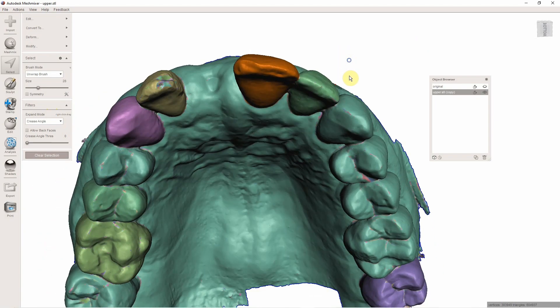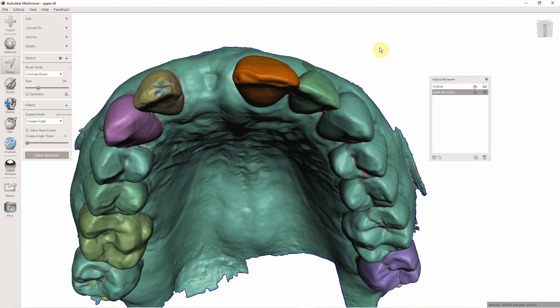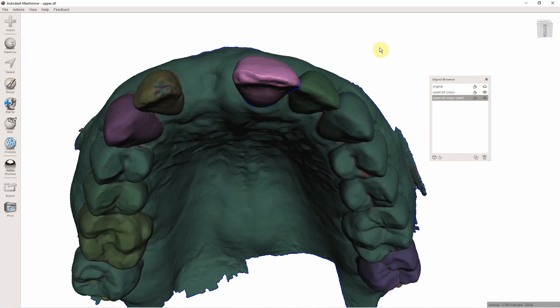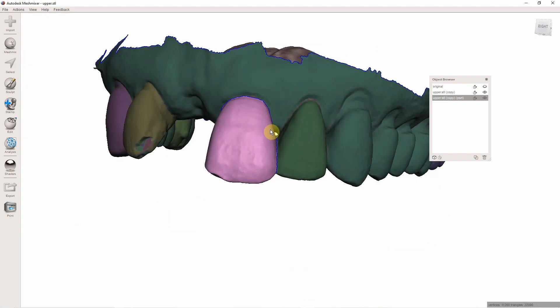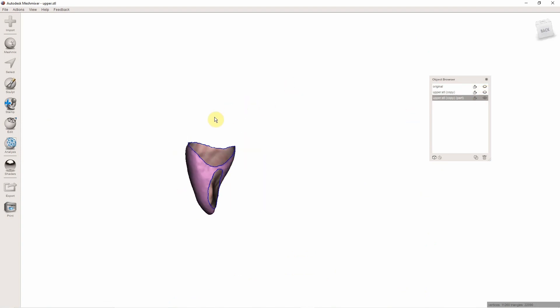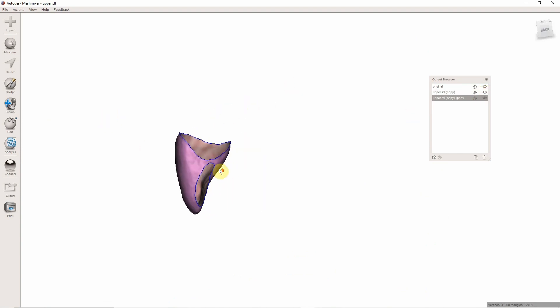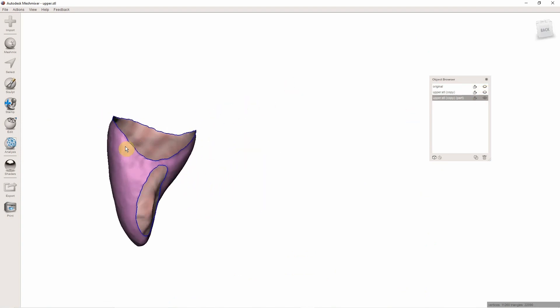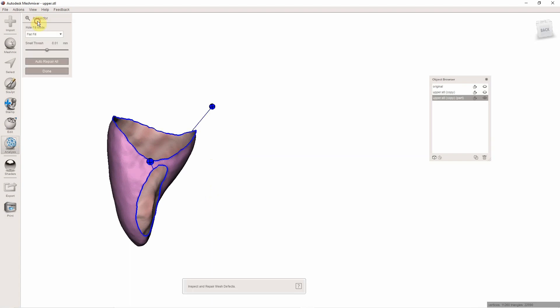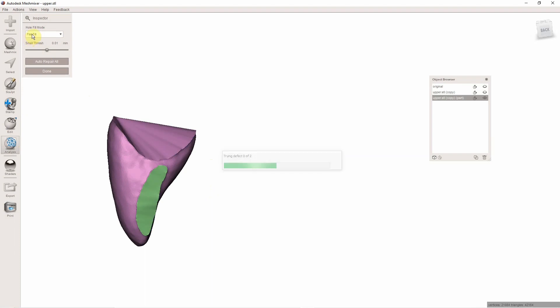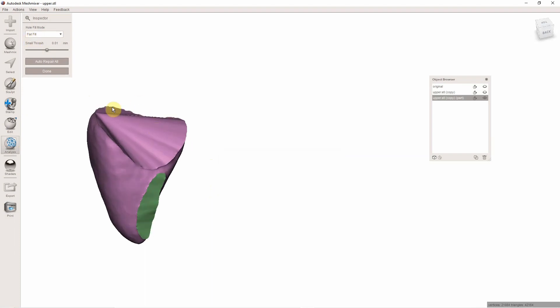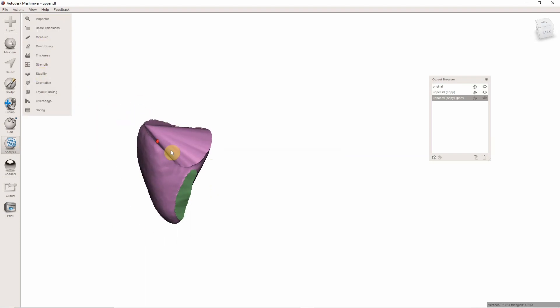So now to extract that tooth, I'm going to hit Y, which makes that its own little mesh. So if you come here, now I have this tooth. To close these holes, I'm just going to go to Analysis, Inspector, Auto Repair All. Make sure Flat Fill is on. Done.